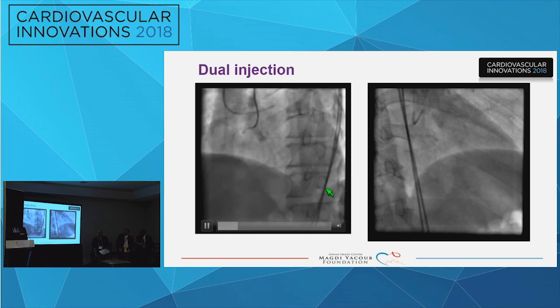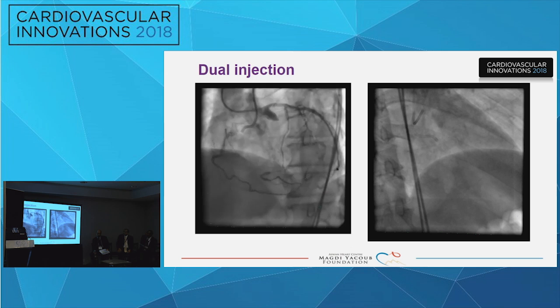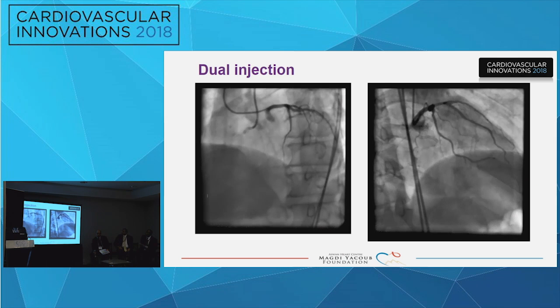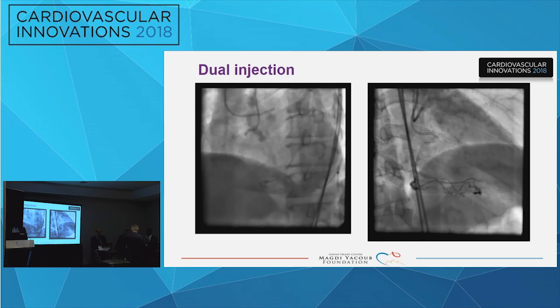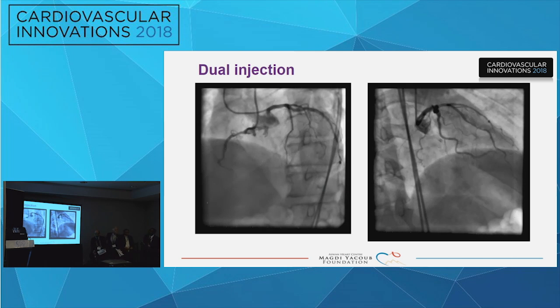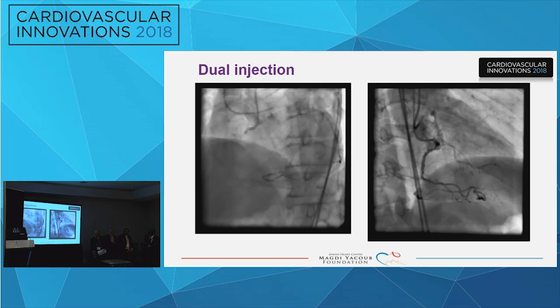This is his angiogram. You can appreciate here a long CTO segment of the RCA. For the collaterals, there is an ipsilateral collateral from the RV branch, epicardial to the PDA, and there are septal collaterals as well to the PDA also.